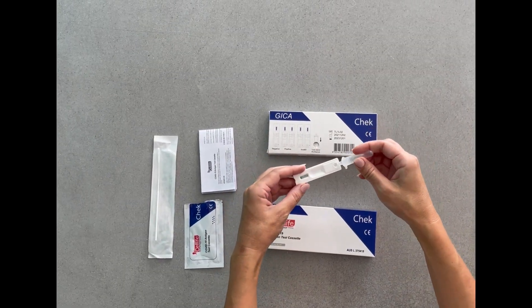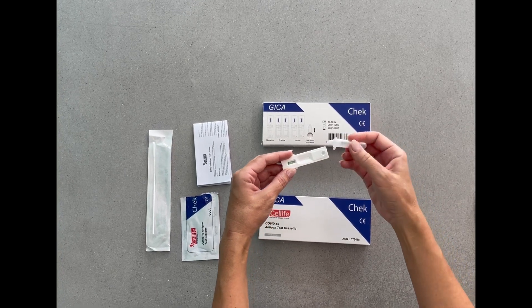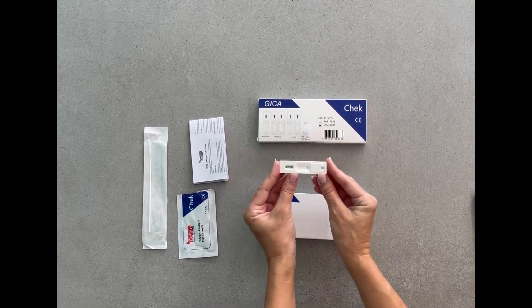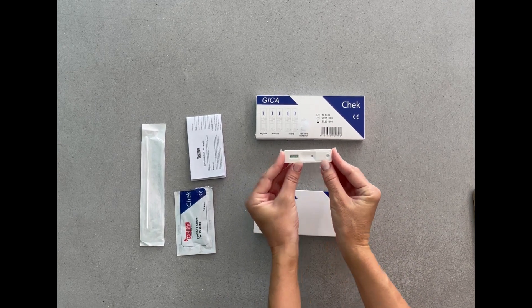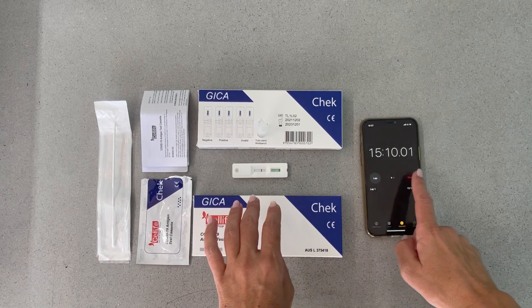Afterward, transfer 3 drops containing the buffer solution into the specimen well of the test cassette. Test results will be ready in 15 minutes.